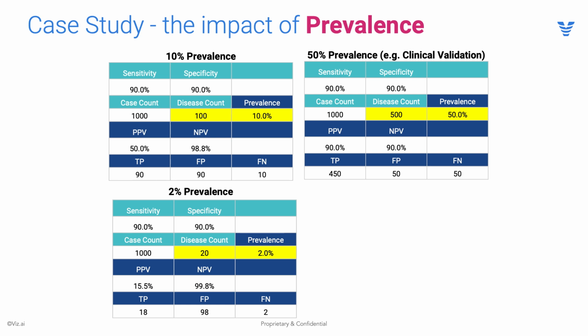Suddenly, if we're talking about, as an example, 98 false positives, 18 true positives. Think about that from an alerting perspective. This is approximately where we were with our first edition of aortic dissection, by the way. It was very close to this in terms of a 15.5% PPV. It was actually closer to 20%. But the experience for the providers was that they would receive somewhere around 4 or 5 false positives for every true positive. And they didn't like that, unsurprisingly.